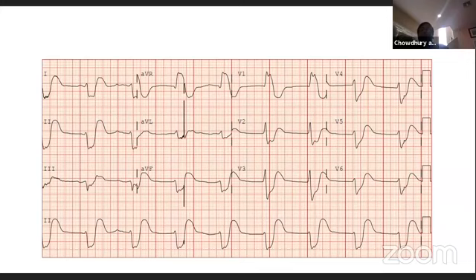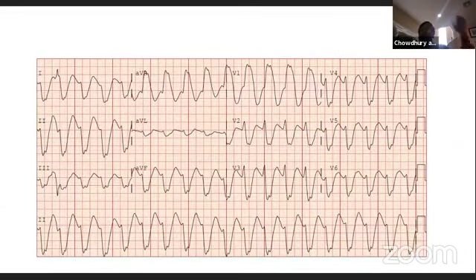And you are absolutely right, Azam, that in the ER, if it is a tachycardia with wide complex, then it can be a differential of tricyclic antidepressant. But I have not seen this wide with tricyclic antidepressant. However, it is possible if they are already in hypotensive shock and late acidosis, but I have not seen one like this. And pectoral fin with tricyclic antidepressant, I have not seen any case report yet. The term pectoral fin has not been coined yet. I'm going to propose this and see whether I can get this published quickly. I have a series of cases now, but this is very fascinating.